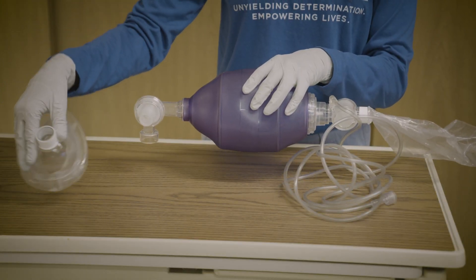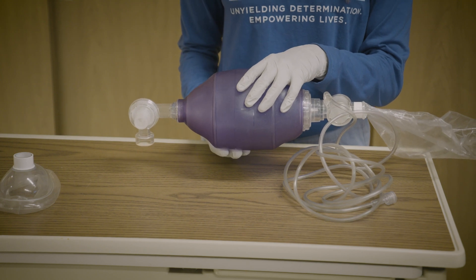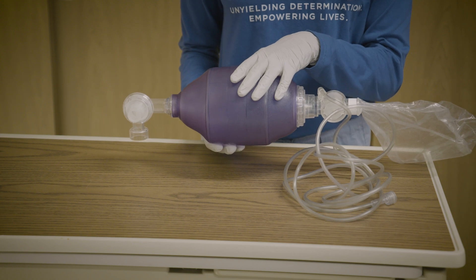After opening the device, make sure to use the correct attachment for the tracheostomy tube. For a person with a tracheostomy tube, you will not use the mask.